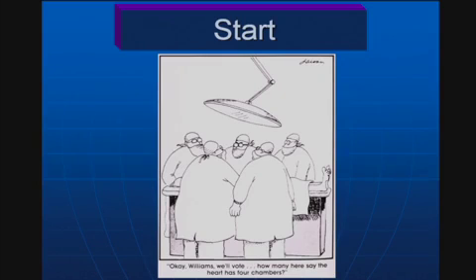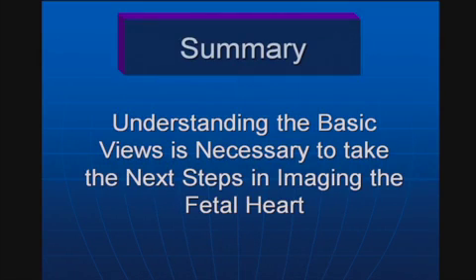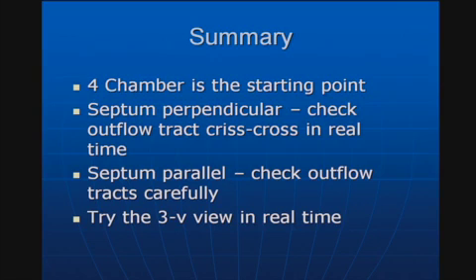And really we have to look first at our starting point with that. So you have to look at the position, the axis, the size of the ventricles. Then you're going to have to look at whether the septum is intact. You have to make sure you see the four chambers. And then after you understand those four chambers, you can take the next step.